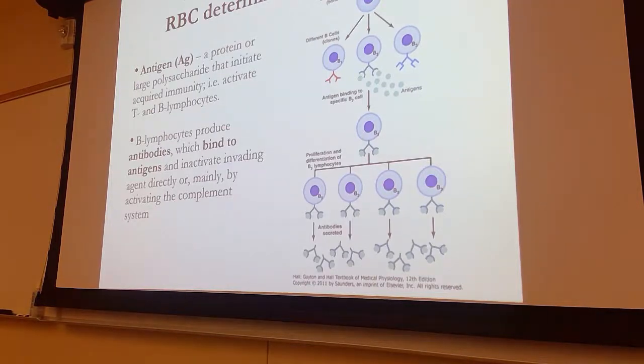Now, when an antibody attacks or recognizes the antigen in your red blood cell, then all the red blood cells will precipitate out of solution. And that's what you saw on the first slide, on the blue colored slide. You saw the clumping, and you didn't need a microscope to see that. It was such a profound immune response that all those red blood cells fell out of solution and formed clumps in front of your very eyes.